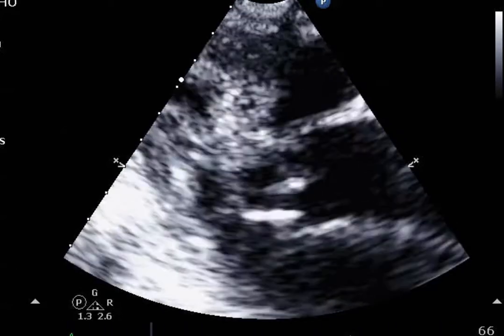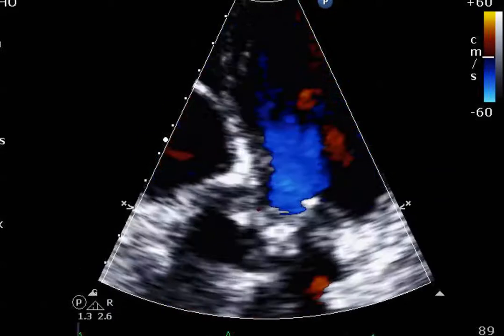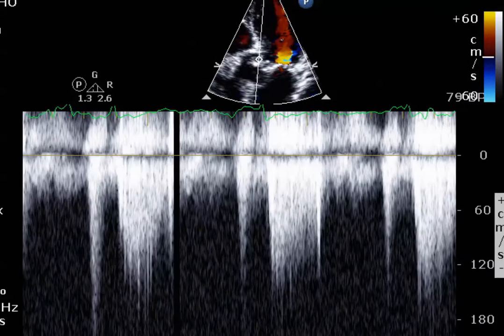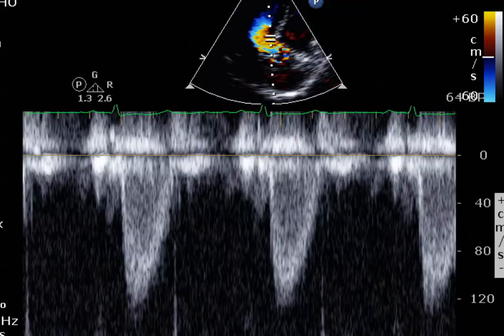What I was surprised to see is that here on the 5-chamber and 3-chamber views, where again you see this turbulence, there are really not a lot of high velocities in that area. We're getting an LVOT velocity here of about 120 centimeters per second, which is a little bit high, but definitely not pathological, so I was a little surprised.